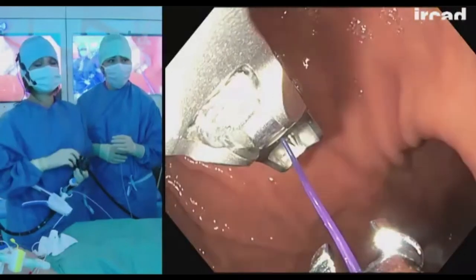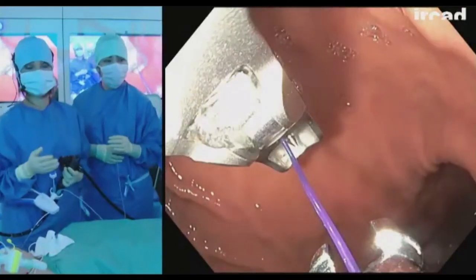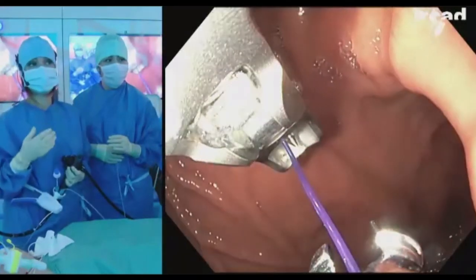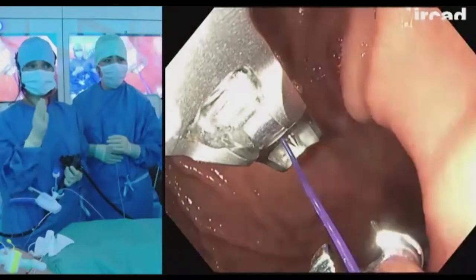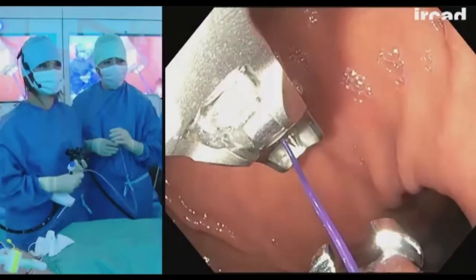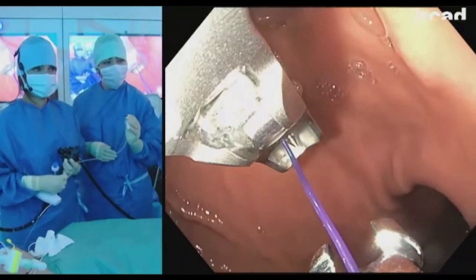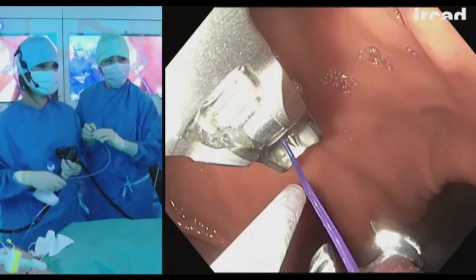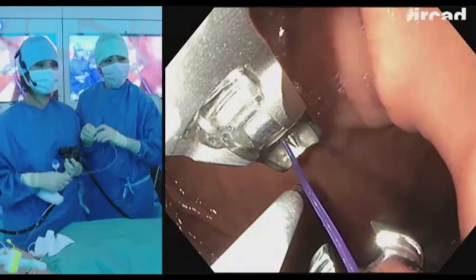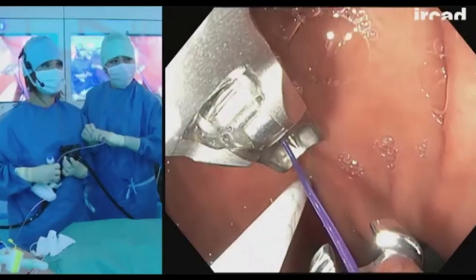I like to start, as I learned from both Lee and Manuel, a little bit far away from the incisura, because the incisura is very muscular, it's very thick, and the stitches will not hold. So it's good to start a little bit behind the incisura, proximal to it, to place the first stitch. It will hold longer. In order to fetch the tissue, Rita is gonna help me manipulate this expose helix device, which is like a corkscrew, and is going to help me grab the tissue and ease it into the jaws of the device. So we're going to start over here.